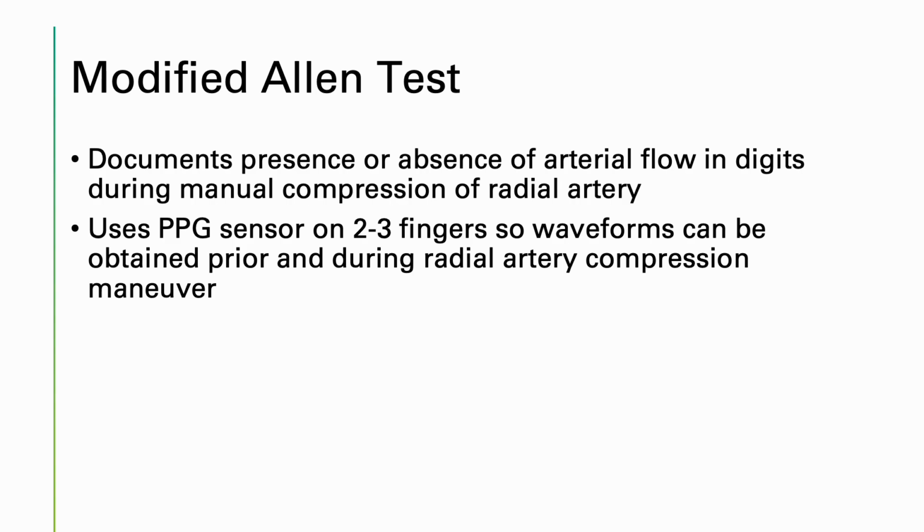I want to review real quick for that. So what I want you to make sure you review after you read the chapters we've gone over and reviewed these PowerPoints multiple times, pay close attention, be sure you can label arm anatomy and talk about it. Know what a normal upper extremity waveform would look like on Doppler and duplex. So remember, we want upper extremity arterial waveforms to be multiphasic, not monophasic. Monophasic would be abnormal. We want them triphasic.